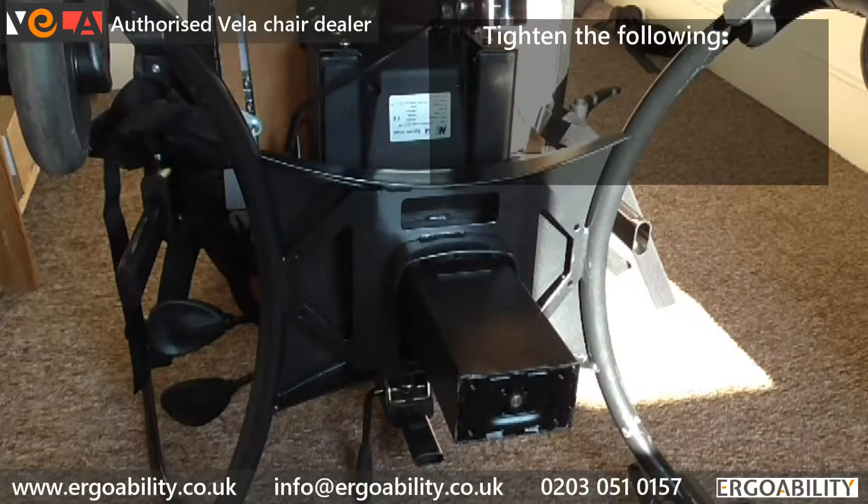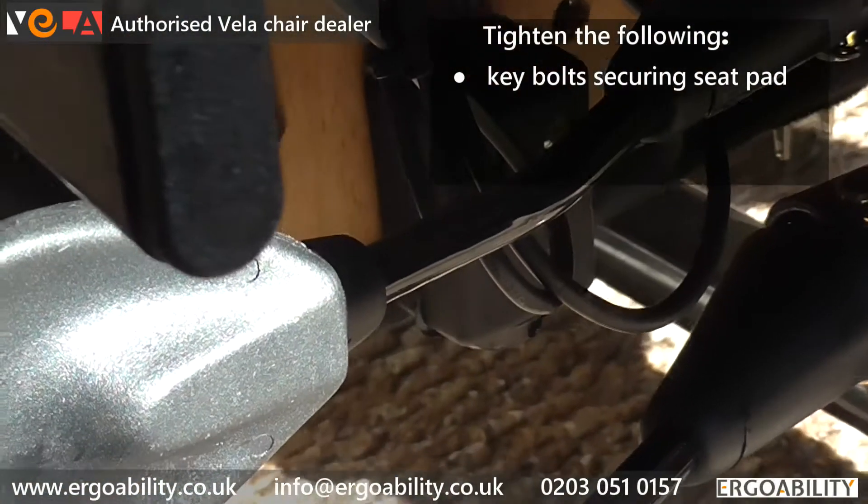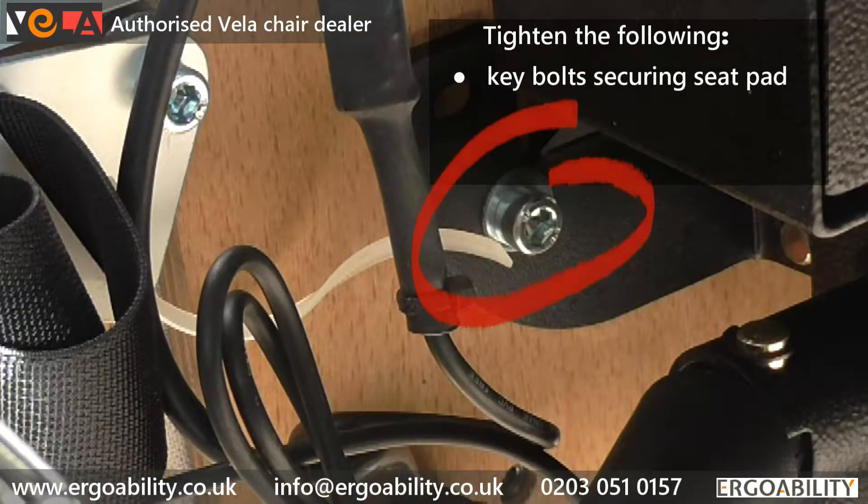Tighten the main bolts on the underside of the chair which secure the seat pad. The chair shown has only four, but there may be more on other Tango chair models.